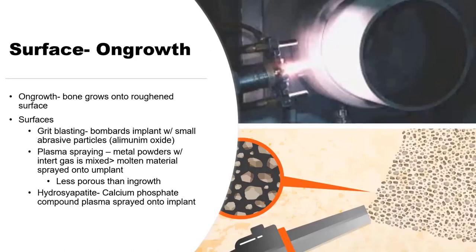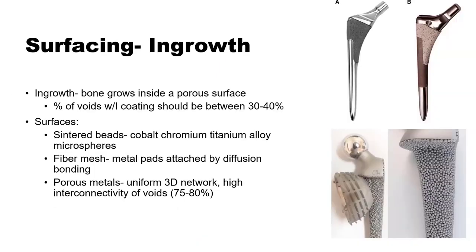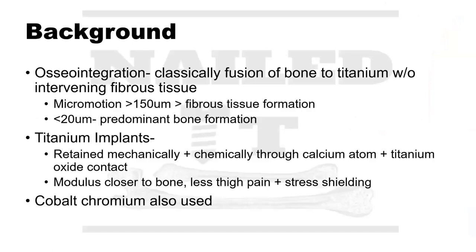Ah, okay. And what material are the implants mostly made of? Are they mostly titanium that most people are using, or cobalt chrome, or what are some of the different things? Titanium in the modern implants is most common for the stems.